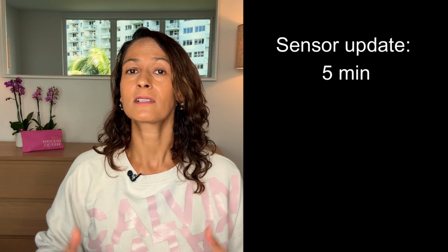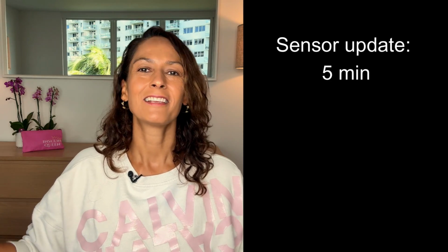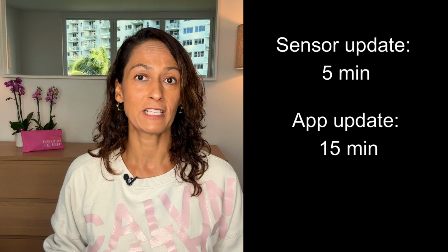With Dexcom Stelo, just as with Dexcom G7, this sensor updates every 5 minutes. However, with Dexcom Stelo, the app only updates every 15 minutes. Remember how I told you that biosensors and CGMs don't measure the blood sugars in the blood, but rather in the fluid underneath the skin? Well, those readings are about 10 minutes behind what's going on in the blood. When you then add the 15-minute app update, that means that the blood sugar reading that you're seeing on your screen could potentially be 25 minutes behind.